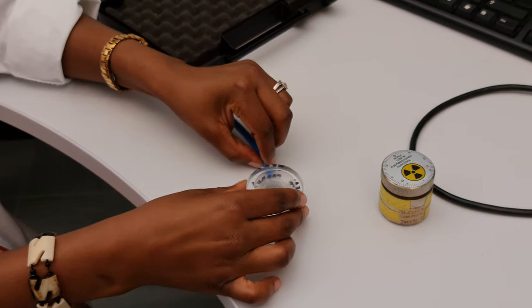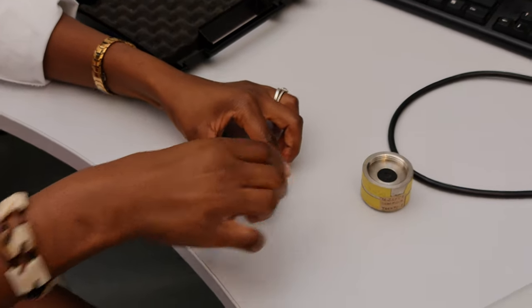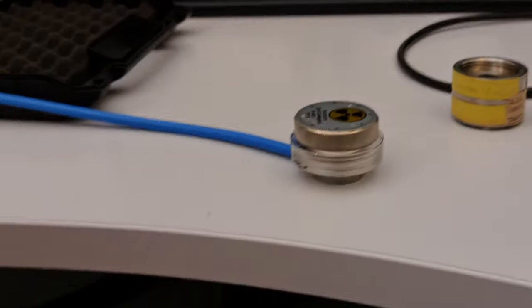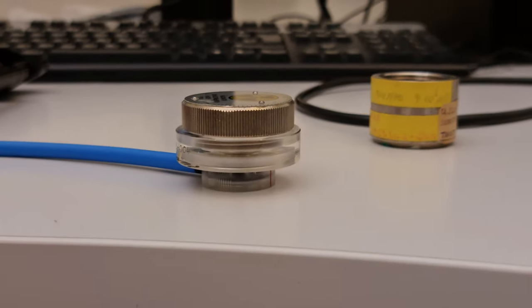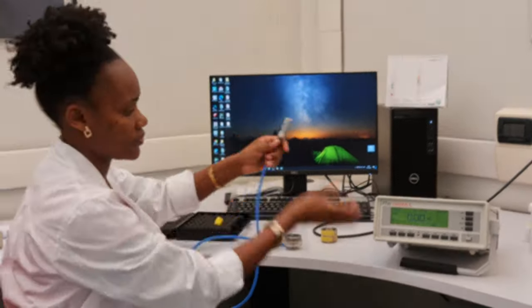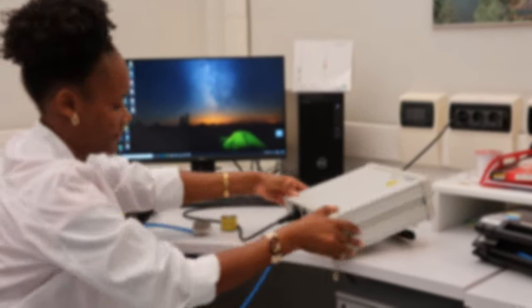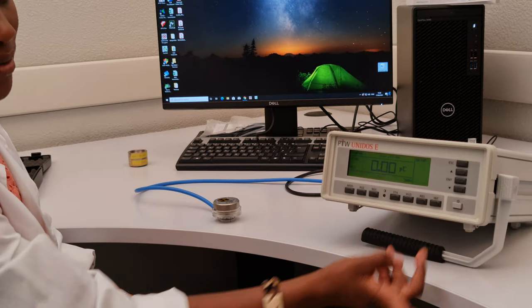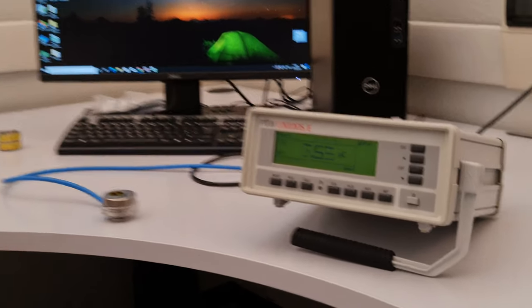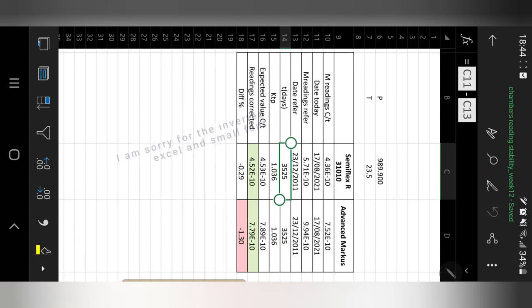For the connections, you take the chamber and place it on the table, then insert the cup or holder. You seat the radioactive source on top of that holder so that it can irradiate the detector underneath. Then you connect the detector to the electrometer and you're ready to take measurements. We took three measurements and got the average.